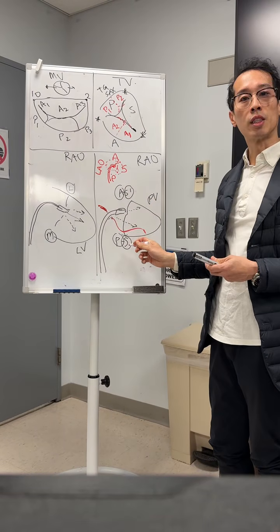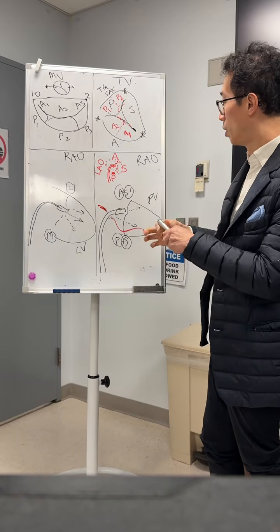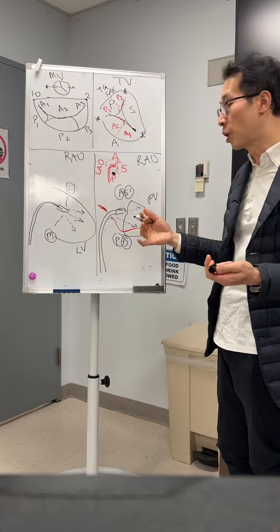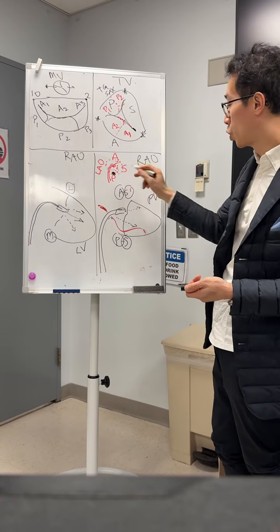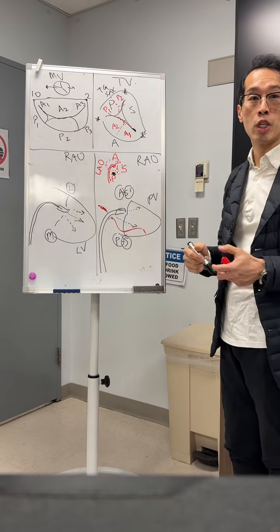You know you're in the PS. So in LAO, your lead will probably be somewhere here. Okay? So you know fluoroscopically you can correspond, so when you start to deploy the anchor, you can check where the anchors are relative to the lead. From here and here, you can then adjust accordingly on these two fluoroscopic projections.